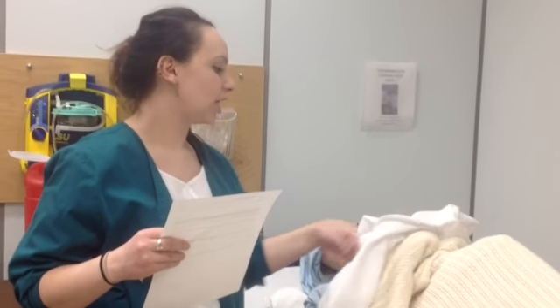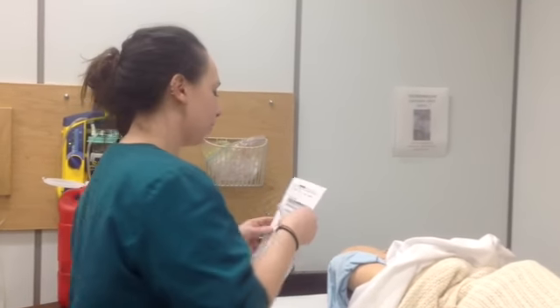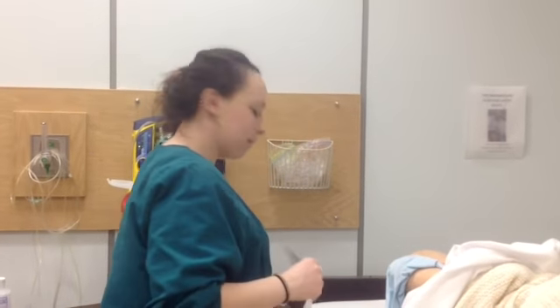You're going to verify with the patient verbally. While you're doing that, you can also do the second verifier, which is checking their bracelet. At the start of the video, my needle was on the table, but it wasn't out of my sight. You do not want to leave your med out of your sight once you have it drawn. It's to stay in front of you. So you can put it next to you as long as you can see it in front of you.